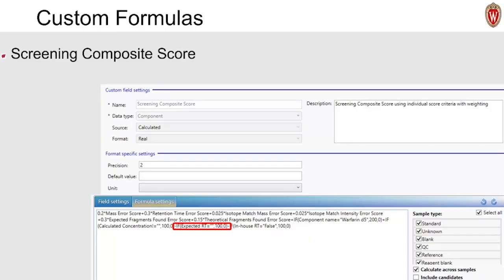What about when we import a new and novel compound that might be coming around, but we don't know if we can see it and we have no idea what the retention time is? Let's put those all the way at the bottom of the list since they'll be speculative hits and there might be a lot of them. Subtract 100 for no expected RT.